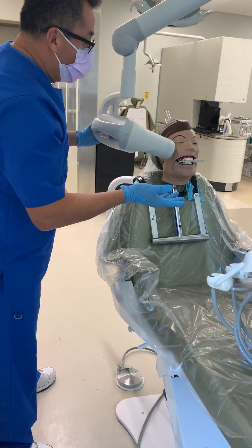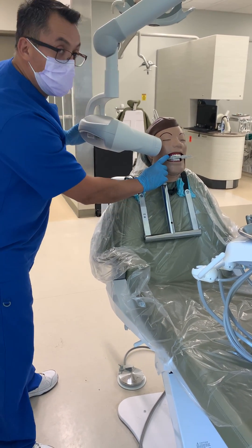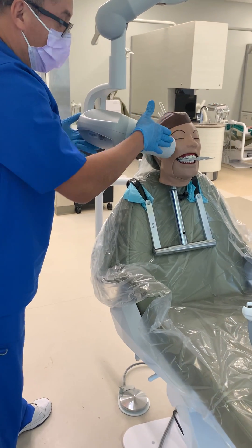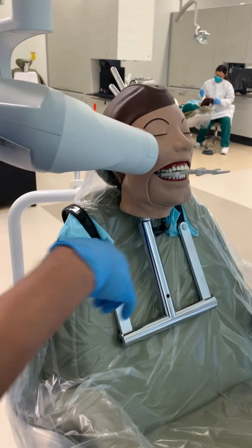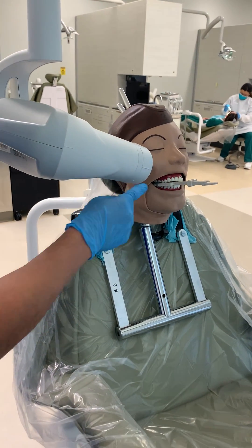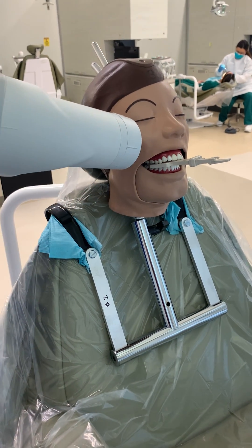Second, we already know that the edge of the film ends up at the mesial of the cuspid. So you're going to align this side of the PID with the mesial. If it's too hard to see, you can always use this little corner as a reference, and if you align it with that corner, you're pretty much there.